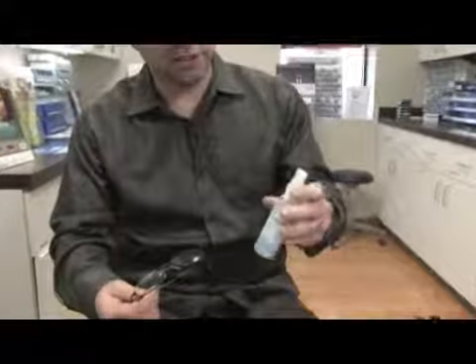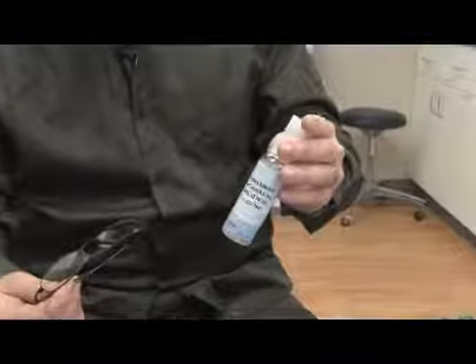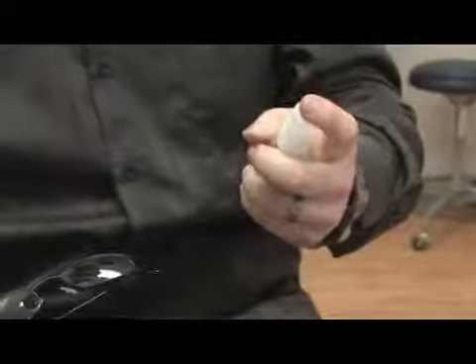The best scenario is that it just got something on the lens that you can get off. Worst case scenario is you've got something on there that's going to erode the lens. But let's go with best case scenario. What we have here is some solution. You should be able to find the solution at any optician's office. They should have this to clean your glasses. This is to get off really tough smudges, okay?